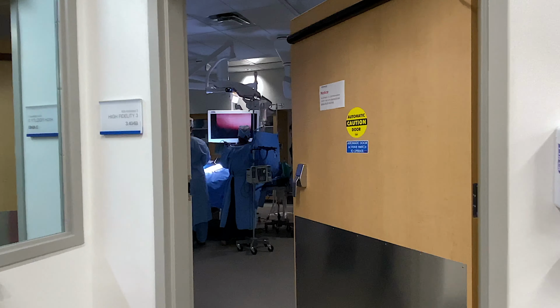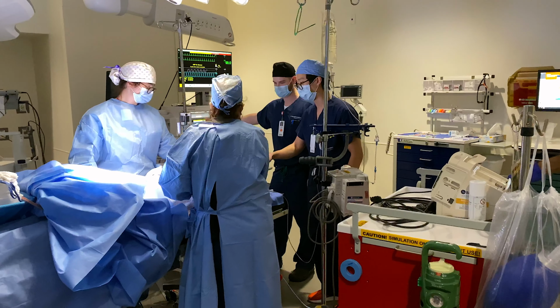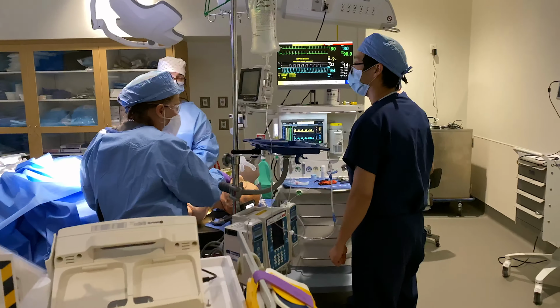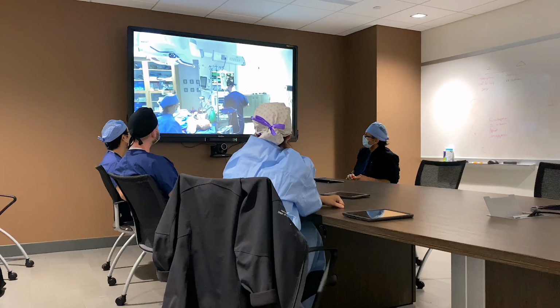The goal of each simulation is to replicate common perioperative events that the residents are likely to encounter during residency and in private practice, but also to touch on some of the zebras that they may not see during their training. So each simulation lasts about 10 to 15 minutes, but the true learning takes place in the video-assisted debrief that follows afterwards. All our simulation faculty have taken simulation instructor courses either at UT Southwestern or around the nation and are certified simulation instructors.